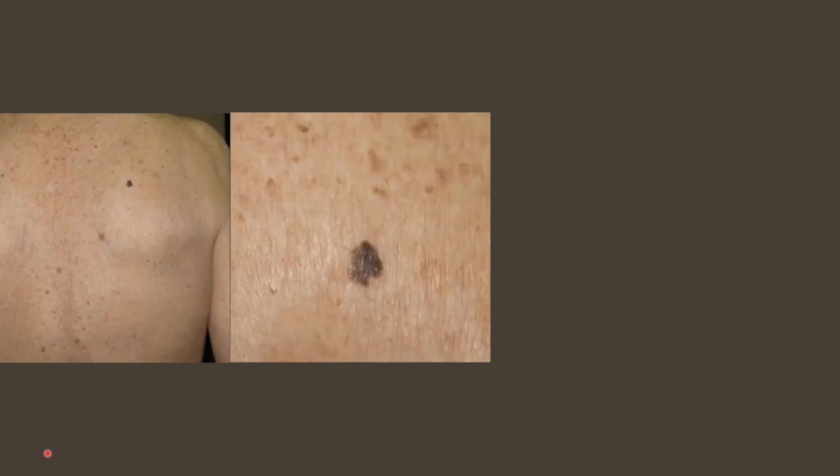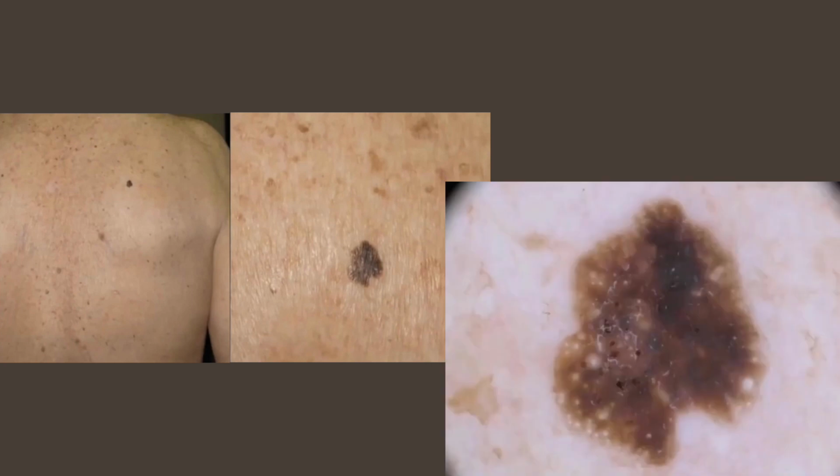Another patient with a small hyperpigmented skin lesion over the back, which looks like an ugly duckling among all his other nevi and sunspots. The close-up view of this lesion. Just apply ABCD of melanoma, the clinical ABCD. This is definitely asymmetric. There is border irregularity, there is color variation, and it's quite dark in color. But on dermoscopy, this was just a seborrheic keratosis.